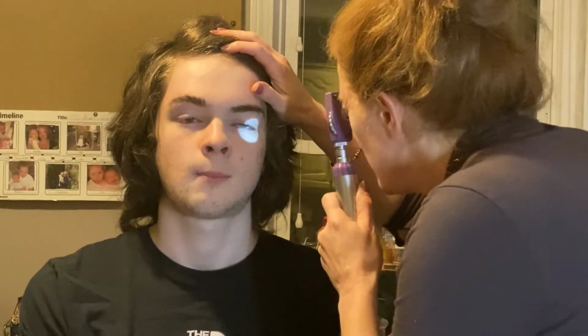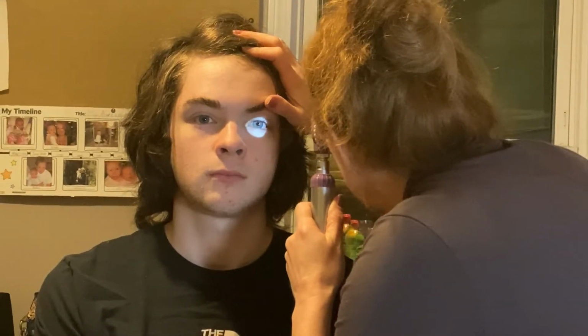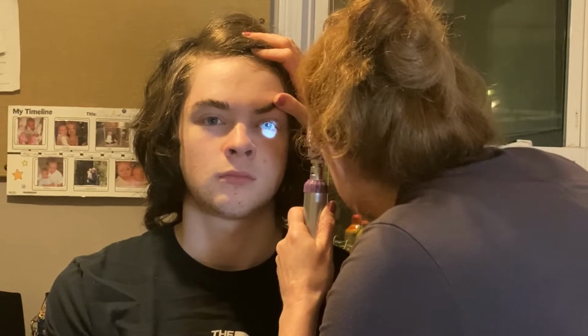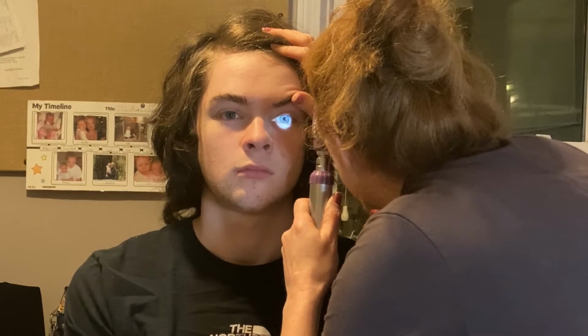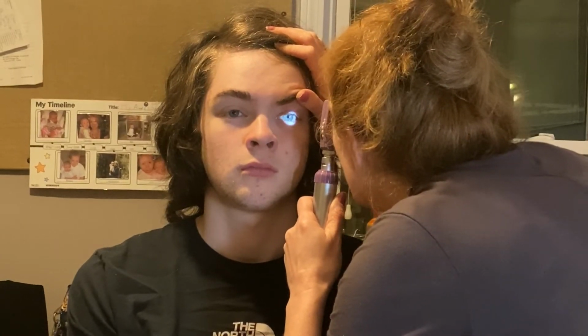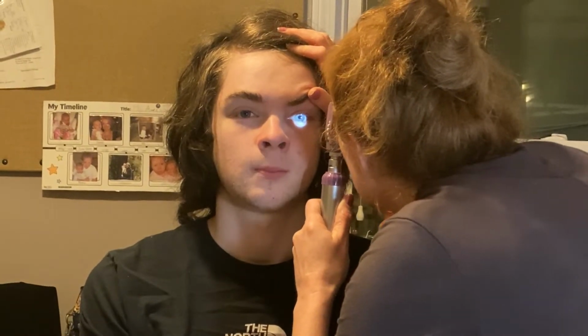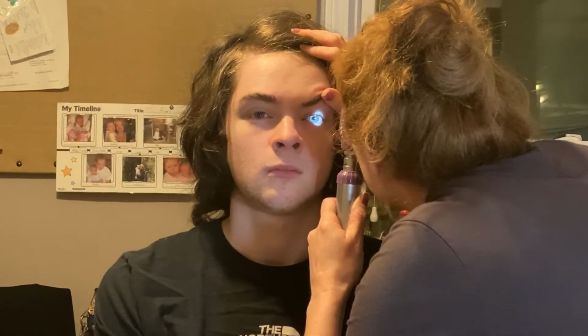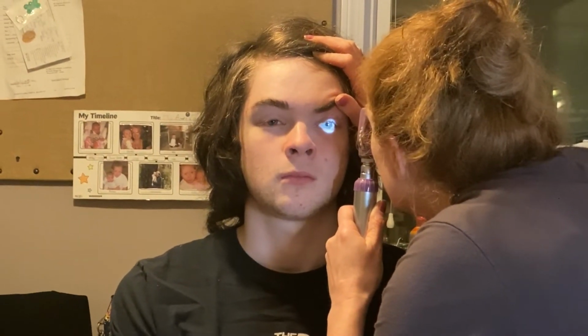So if you look straight ahead to an object on the wall, perfect, red reflex. Just gonna move closer. Perfect, there we go. Optic nerve is normal color, there's clarity, no hemorrhages, vessels, arteries and veins visible. Now if you can look into the light, macula is normal, no hemorrhages or lesions.